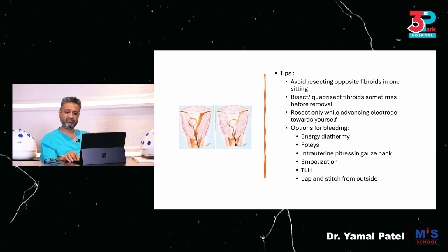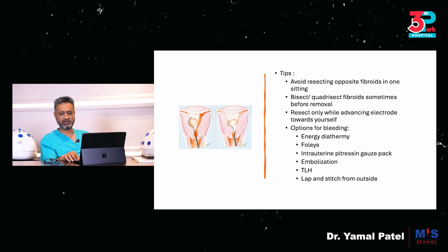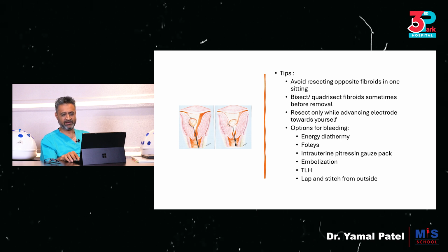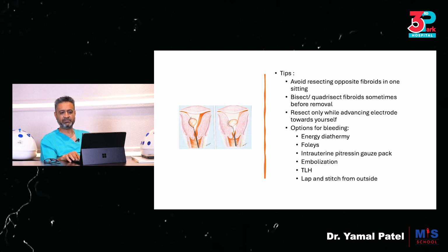You could use embolization, you could end up sometimes doing a hysterectomy, which is going to be catastrophic because you're planning a myomectomy and converting it to a hysterectomy. Be very careful in this. It might lead to unnecessary medico-legal issues, but to save a life, it may be necessary. It might also be possible to go in laparoscopically and stitch from the outside and reduce the bleeding so that you can avoid a hysterectomy.